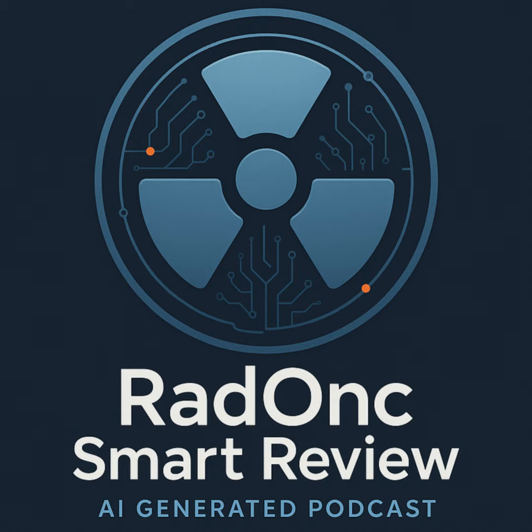Correct. And the radioactive tag that makes this whole thing visible is fluorine 18. 18F, that's the atom that emits the positron. Okay, and why 18F? Is there something special about its properties? Well, it hits a sweet spot, especially for whole body imaging. Its half-life is about 110 minutes. Just under 2 hours. Right. Which is long enough to actually make the FDG in a cyclotron, do quality control, ship it to the clinic if needed, inject the patient. Let it distribute in the body, which usually takes about an hour. Exactly. And then get them into the scanner and acquire the images. It all fits nicely within a few half-lives, but it's also short enough that the radioactivity decays away reasonably quickly after the scan, minimizing the patient's dose.